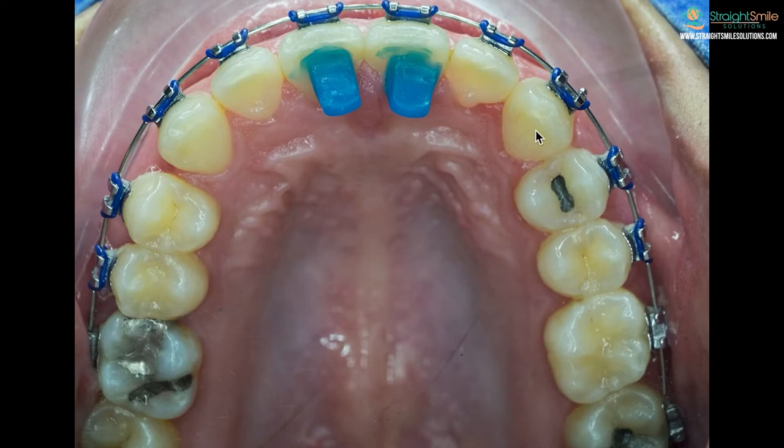Your doctor may be of the opinion that you shouldn't have these, and instead they'll just put the top braces on first and put the bottom ones on when it's time. There's really no wrong or right opinion — people have very strong opinions on this topic — so you can always ask your doctor what they think is best.